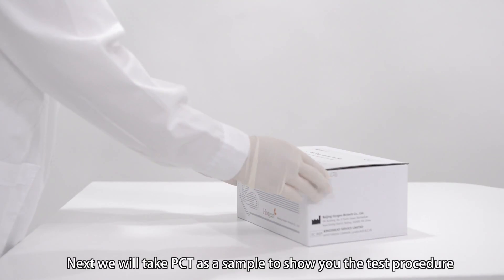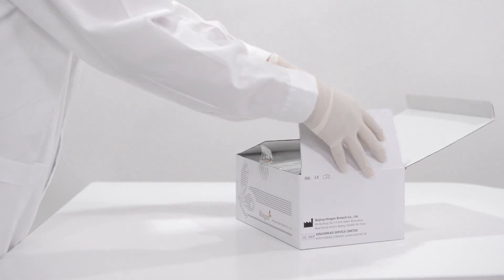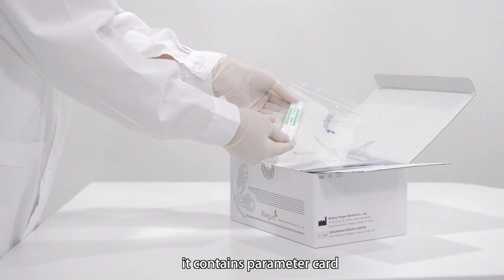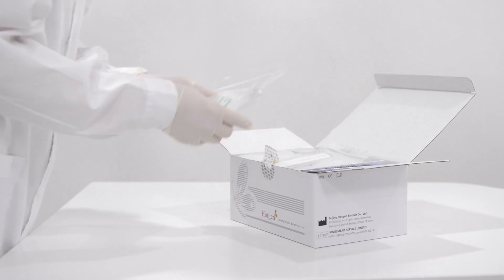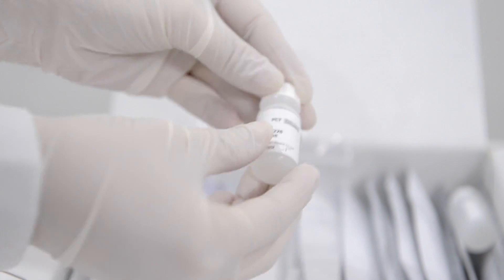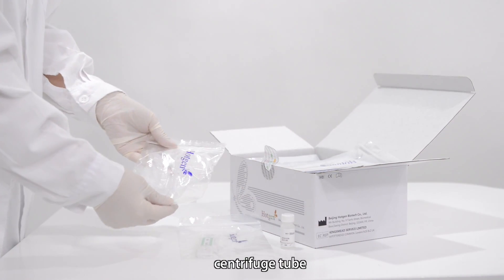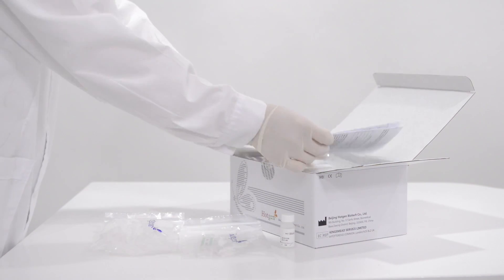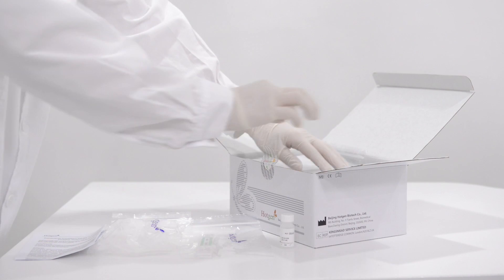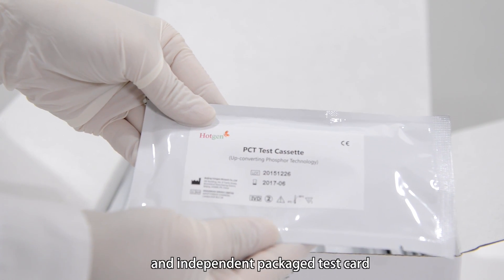Next, we will take PCT as a sample to show you the test procedure. Open the PCT kit. It contains a parameter card, diluent, centrifuge tube, product instructions, and an independently packaged test card.